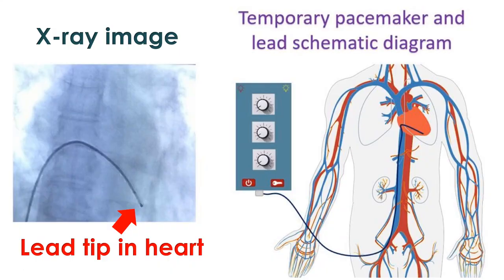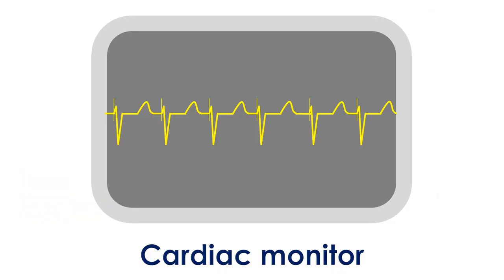While the temporary pacemaker lead is in the heart, the person should avoid too much movement as the wire tip might perforate the right ventricle. This does not apply to permanent pacemaker, which uses a softer lead. If the temporary pacing lead has been introduced through the groin, movements of the legs will have to be very cautious if any. Usually, such persons are monitored in an intensive care unit until either the heart rate recovers or a permanent pacemaker is implanted.